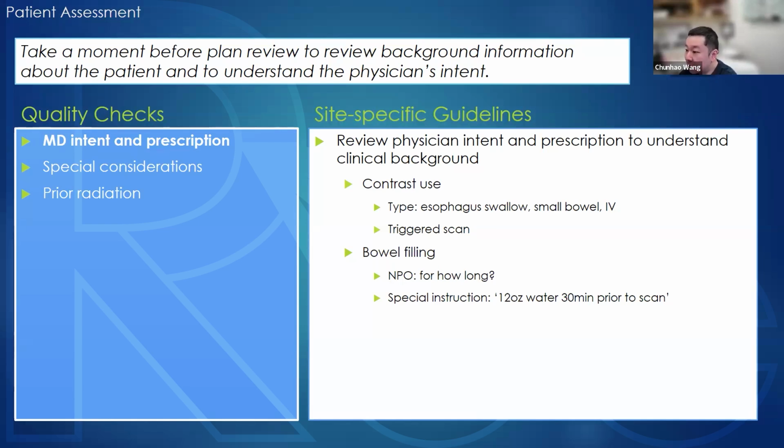This is to give some time to have the water into the duodenum at the time of the scan, so it will show a bulged appearance with a better differentiation from the pancreas head.